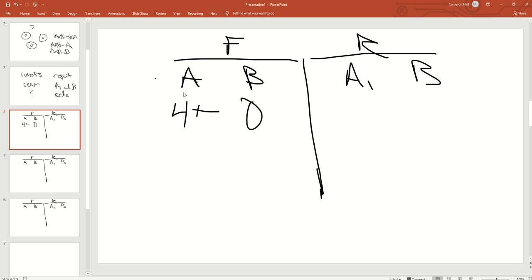So what does anti-A react with? It reacts with A antigen. So that would lead us to believe that the patient has A-type cells. And then over here in B, we see 0, we see no reaction. So we should be thinking the patient does not have B antigen on their cells. So with that in mind, what should we expect in the reverse?